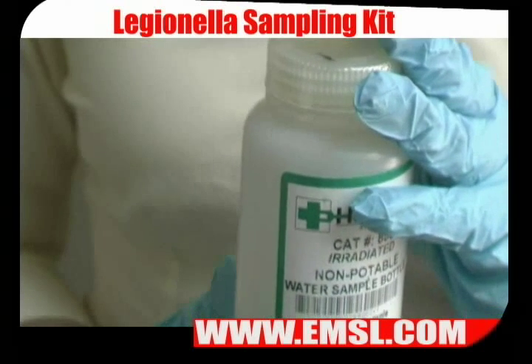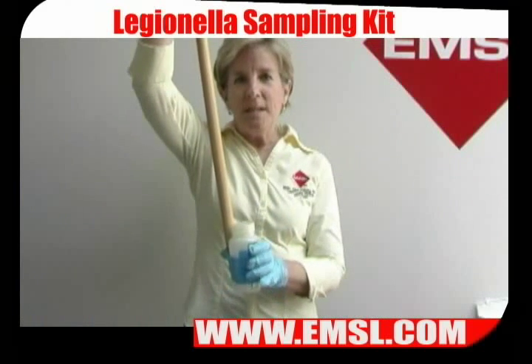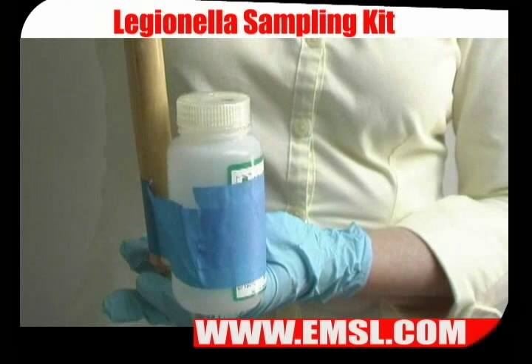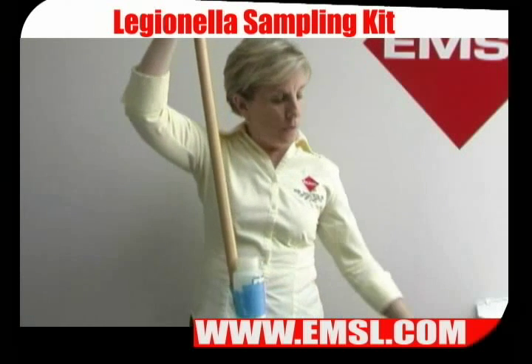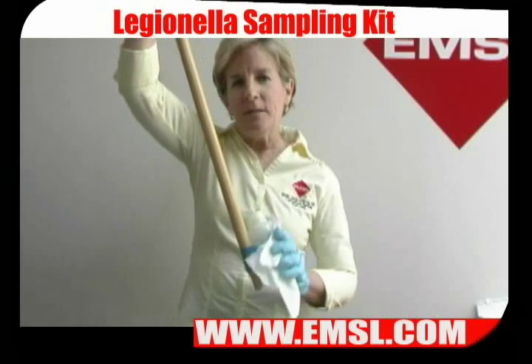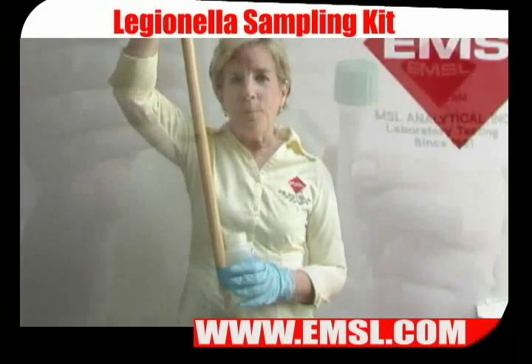If you're sampling from a cooling tower basin, use electrical tape to tape the bottle to a long stick so that you can submerge the bottle into the cooling tower basin without submerging your hand. When you're finished taking the sample, take an alcohol wipe, wipe down the outside of the bottle, remove it from the stick, label it, and prepare it for shipping.